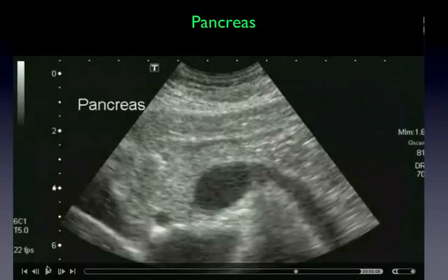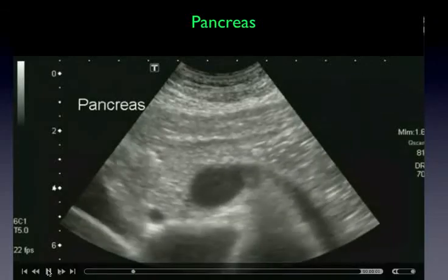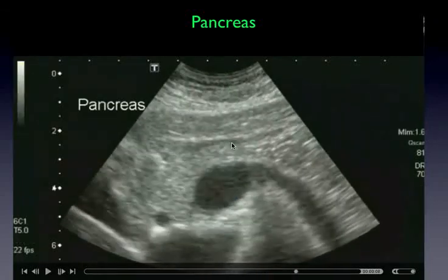And then if we go back again over here and take a look, this comes out of the plane of the pancreas over here. This, you can actually make out the edge of the pancreas here. So what's in this direction? We know duodenum's over here. We know spleen is over here. Up here is stomach. So this is coming from the stomach, I believe. And now we'll see, again, vascular. Well, they were thinking the duct isn't vascular, but neither is the stomach.